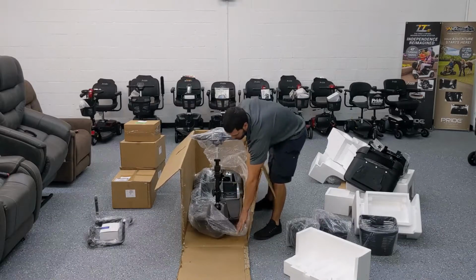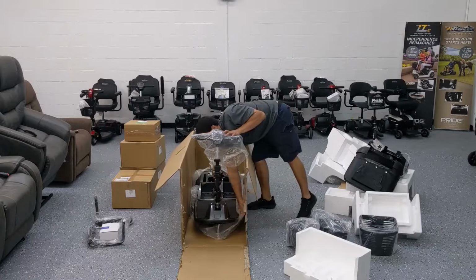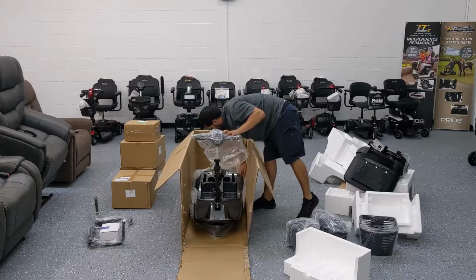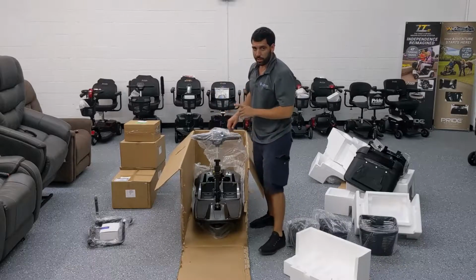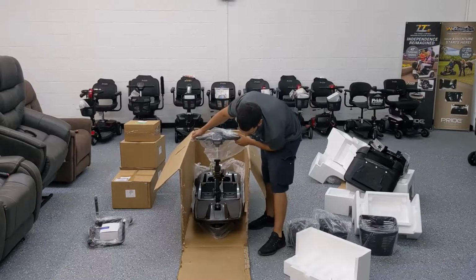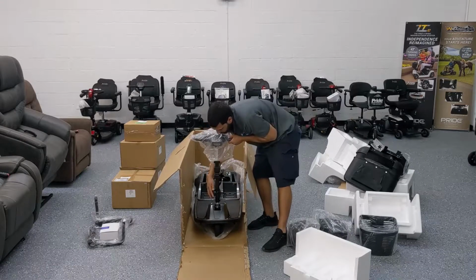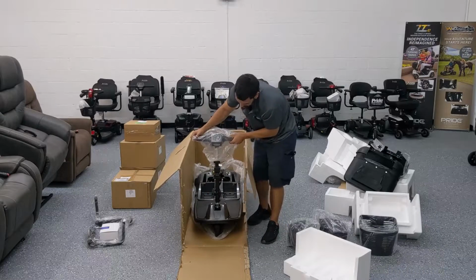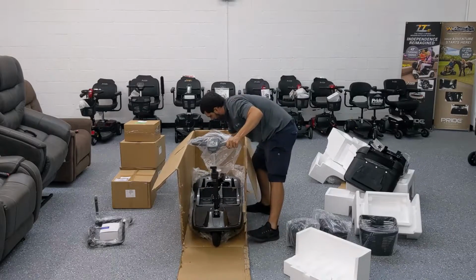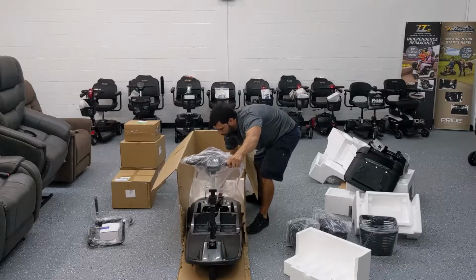So you want to get this plastic out of the way so that the unit rolls right out of the plastic. Okay, so remember, we already disengaged the drive mode lever, so it should just freewheel right out. Remember, you got to tighten this if it's loose like I just had it there. Now it's tight. And maybe you have to pick up the back a little bit to wheel it off. There you go.